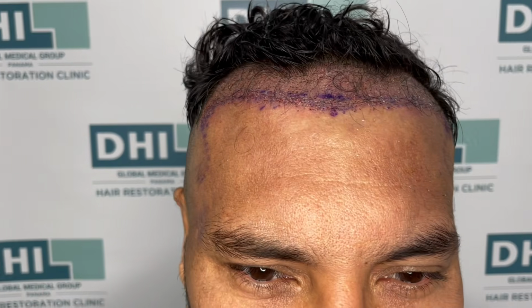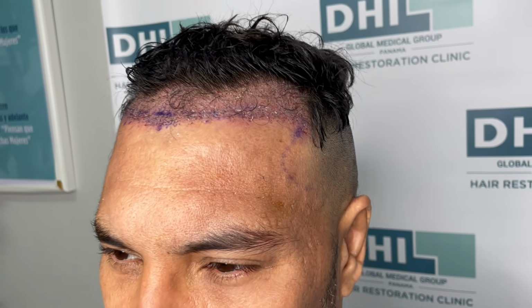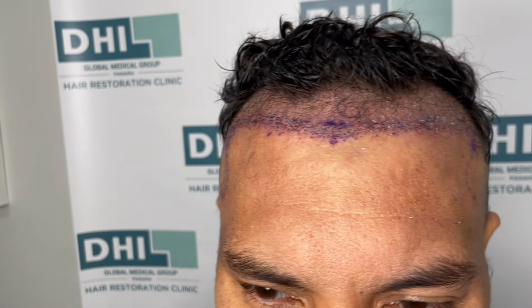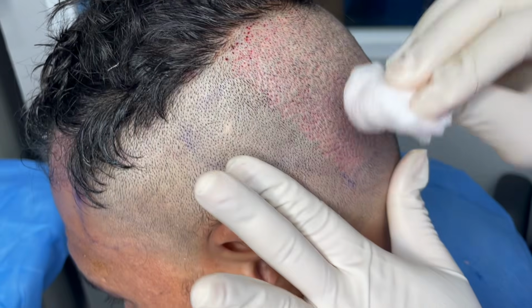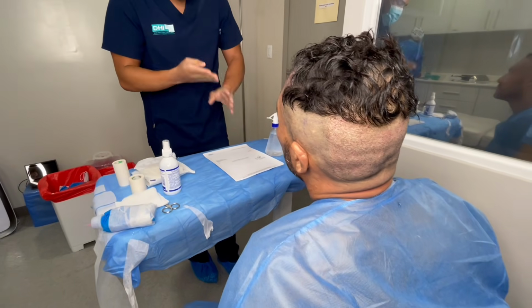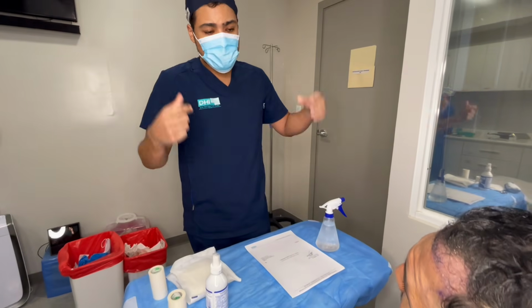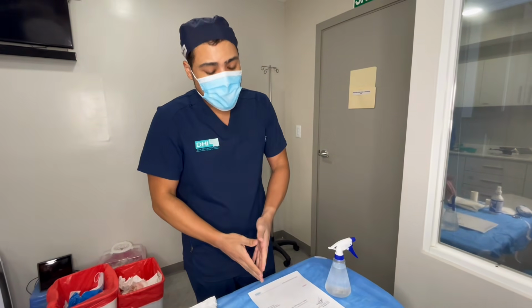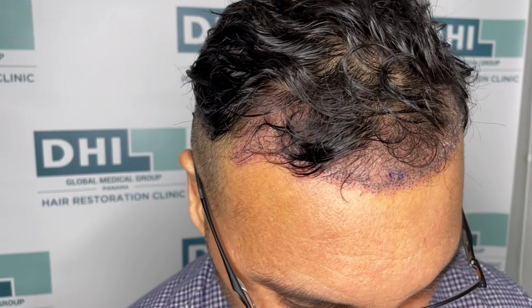Step 8. Final review. Once the planned number of hairs has been implanted, our team performs a detailed final review. We assess the distribution, density, direction, and design of the implanted area, as well as the condition of the donor area. At the end of the procedure, the patient receives specific instructions regarding washing, sleeping position, scalp care, and the activities that should be avoided during the first few days. A new stage then begins: recovery and growth. What happens after the transplant?